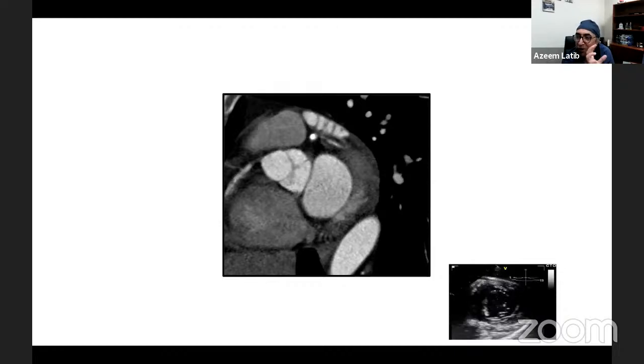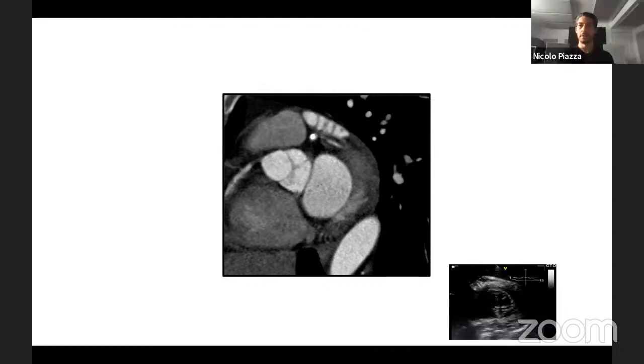And we all forget that all the techniques of transeptal puncture are very much based on normal size atria, right? And then once suddenly one atrium is bigger than the other, it changes all that anatomy. And what you would normally do to get a good MitraClip puncture in another patient may not work. Right? And you need to suddenly go more inferior to get a better puncture.